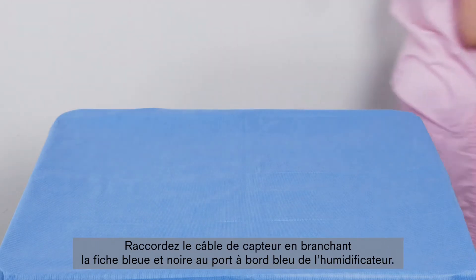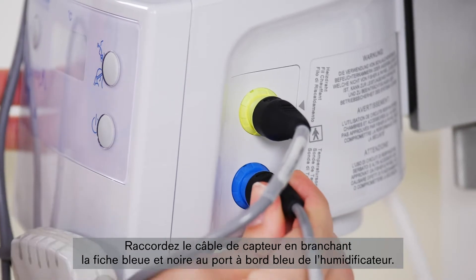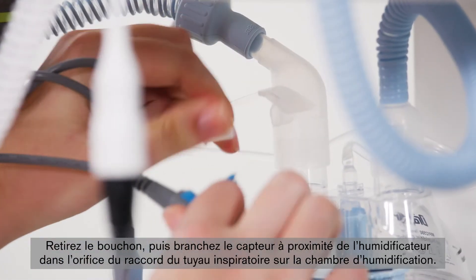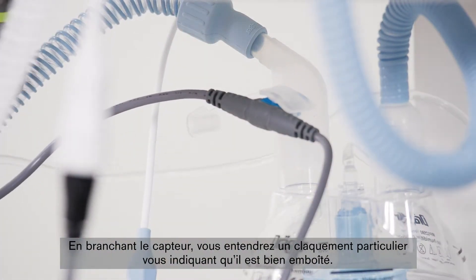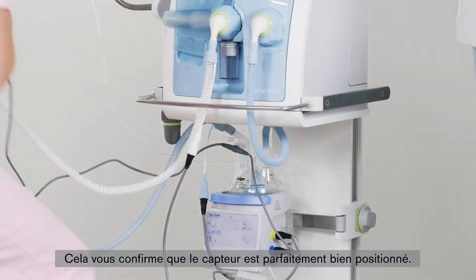Connect the sensor cable by connecting the blue-black plug to the blue-edged connector provided for this purpose on the humidifier. After removing the sealing cap, plug the sensor close to the humidifier into the opening of the inspiratory hose connection on the humidifier chamber. When connecting the sensor, you will hear a distinct sound indicating that it has snapped in. This ensures that the sensor is in the best possible position.